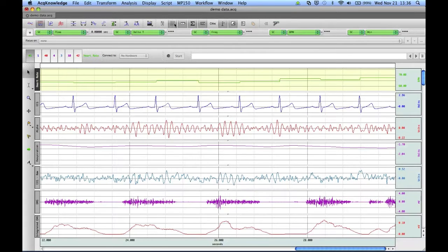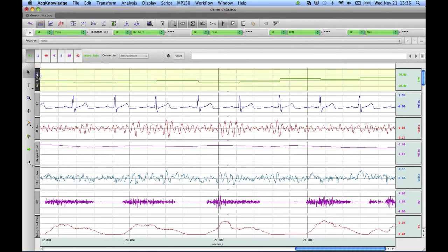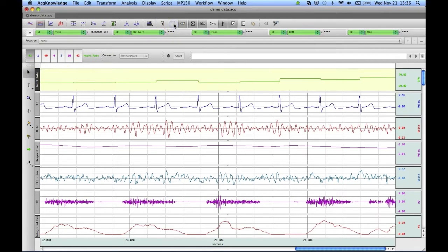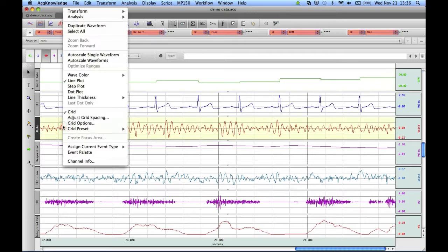You can also disable grids for a specific channel by clicking on the channel to make it active and clicking the grid button, or by right-clicking on the channel and deselecting the grid.